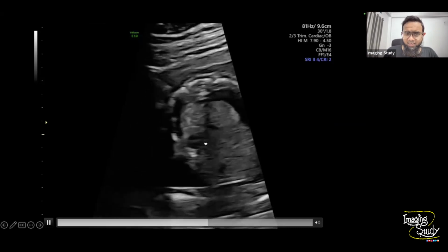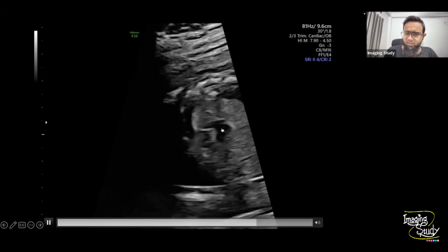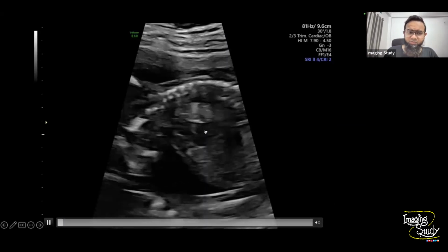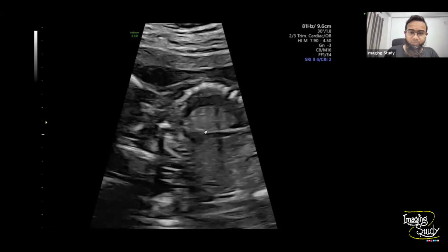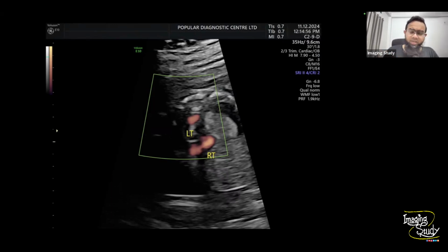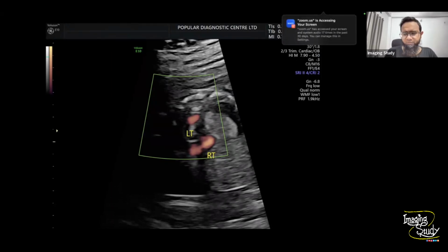You see, the right heart is pumping. This is the left side. You can't see it quite well. I know this is not a satisfactory view, but we try to search for the left heart and we know what we are looking for. So we put some Doppler. Unfortunately, we couldn't save the clip of the Doppler. Anyway, on the right, there was a good inflow, but on the left, there was apparently no flow, or it was quite ill-defined flow. So we are suspecting hypoplastic left heart in this case. To make the confirmatory diagnosis, a follow-up after 2 weeks will be enough.